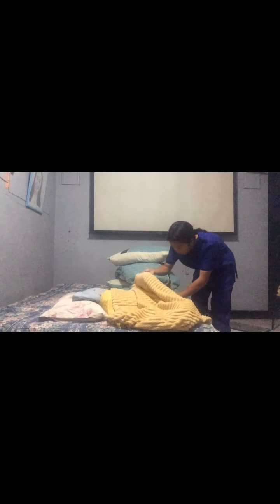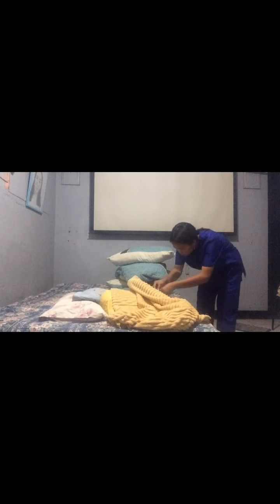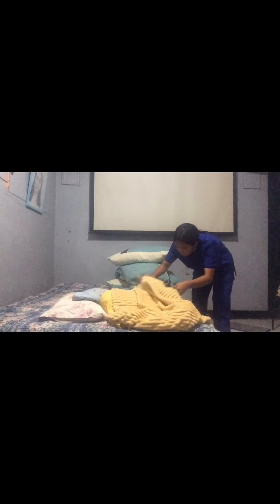Identify the type of collecting tubing attached to the catheter. Identify the patient. Explain the purpose of the procedure and provide privacy. Clamp about 4 inches below junction of drainage tubing and catheter. Leave it clamped. Wear gloves. Cleanse specimen collection port of drainage tubing with alcohol swab. If no collection port is visible, cleanse catheter tubing.